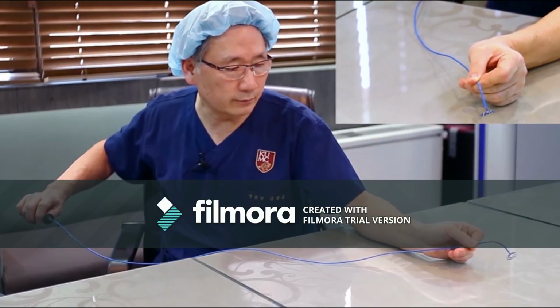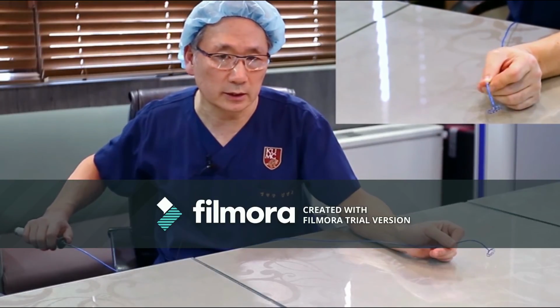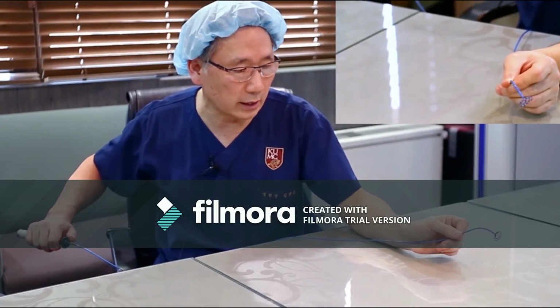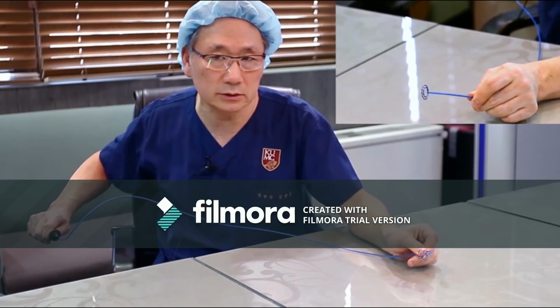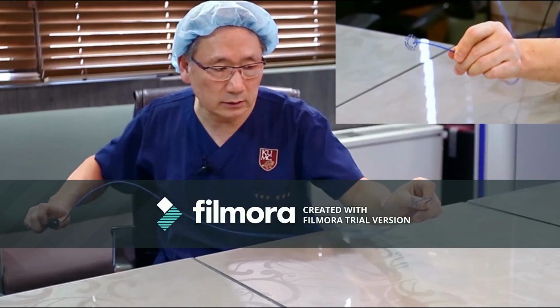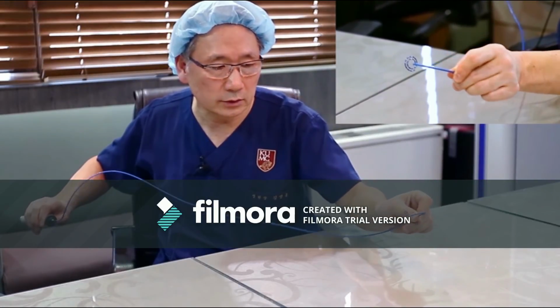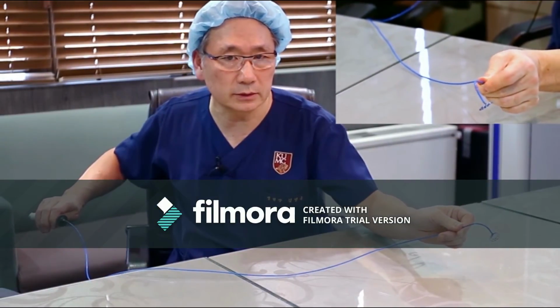But the RIPV is sometimes very difficult to insert because your puncture is a little bit anterior. In that case, once again, you better go to the LIPV first. LIPV, fully deflect, more deflect, and then from here, atrial view, clockwise, clockwise, clockwise. That's the RIPV.